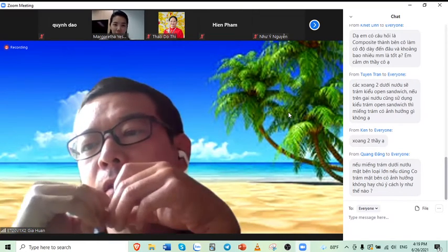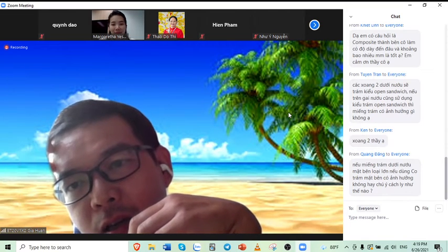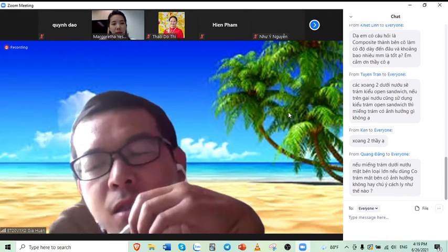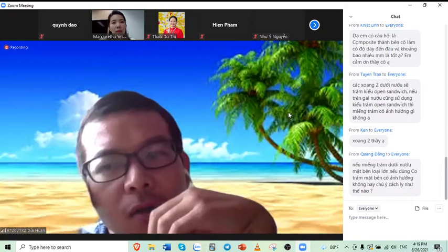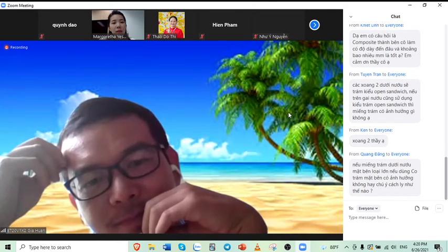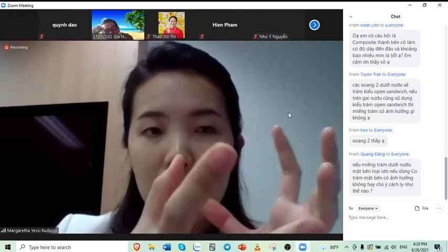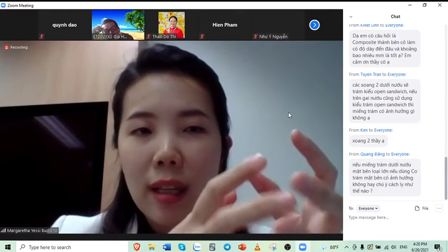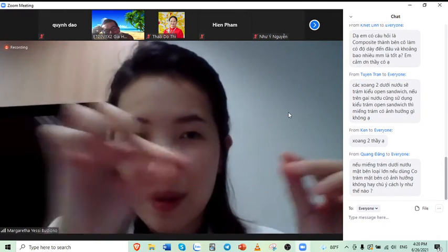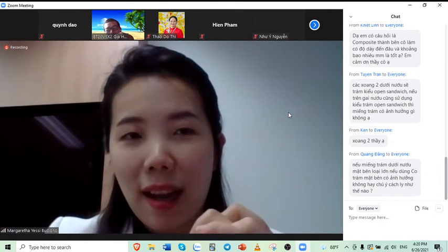Okay. I don't understand the question much, but it goes like this: in a large cavity, the material that replaces the dentin, will it be glass ionomer or resin? In a large cavity, because it needs reinforcement, we advise using EverX Flow. This EverX Flow is composite resin, but it has fibers inside. So it's a resin, it's not a glass ionomer.